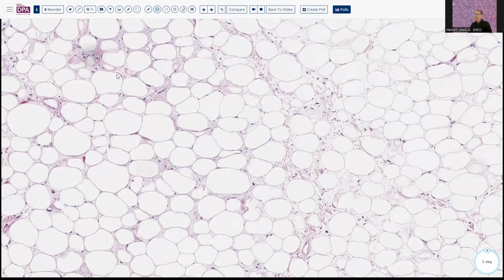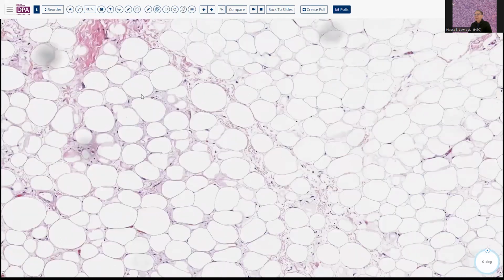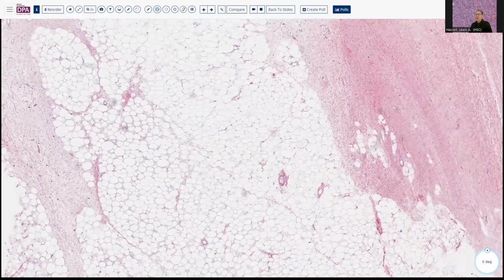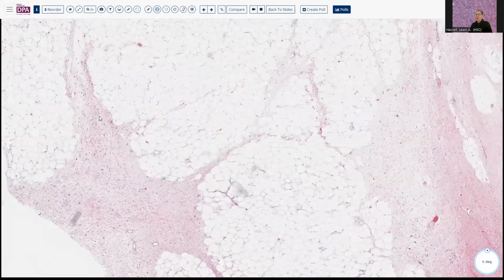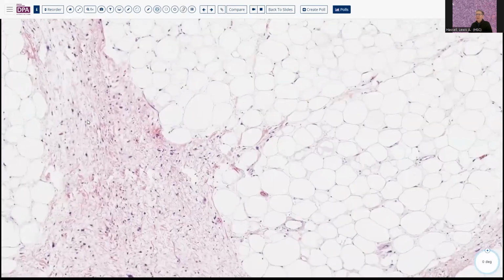And that's kind of the process by which this becomes more fibrotic. So here you see a little bit of atypia here, but these cells would not be considered diagnostic. They might be enough to prompt you to do either the immunohistochemical or the FISH testing to see if you have the MDM2 changes that are specific, or alterations that are specific for well-differentiated liposarcoma.